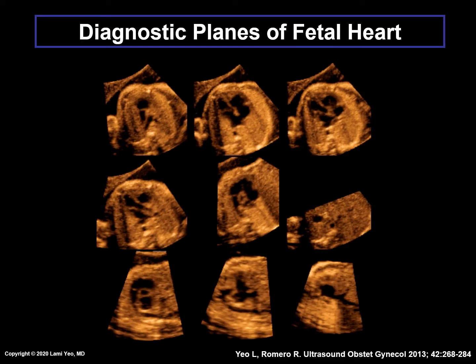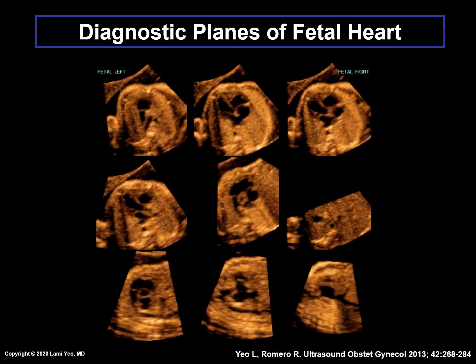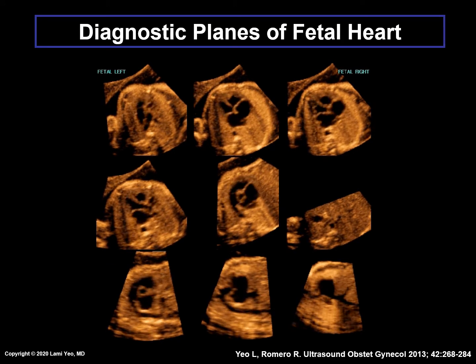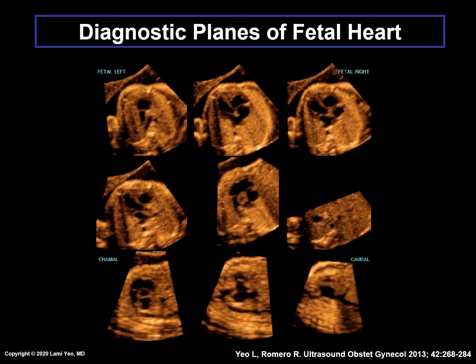Here are the nine cardiac diagnostic planes displayed in a single template. For the purposes of this presentation, the various features of automatic labeling with FINE are shown in sequence. This can be seen for the fetal left and right sides, cranial and caudal ends or direction, each diagnostic plane, and finally the anatomical structures.